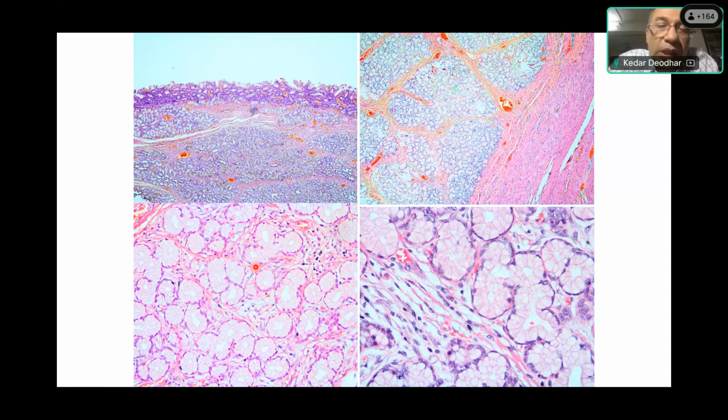Generally, Brunner's gland hyperplasia or hyperplastic change can impart nodularity to the endoscopist, and it may look like small raised nodules, as a neoplasm. These are the same appearances on endoscopy with small neuroendocrine tumors or tumorlets. So just remember that Brunner gland hyperplasia may be seen on endoscopy as a fine nodularity.